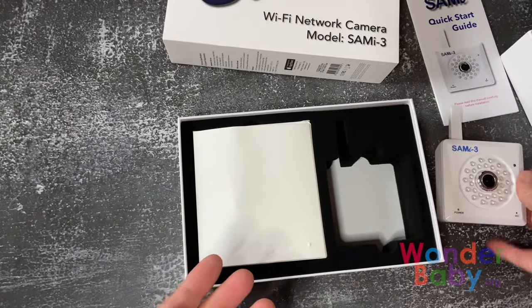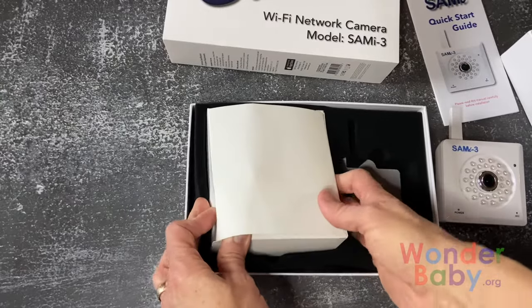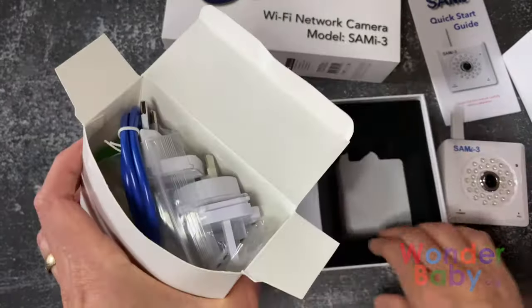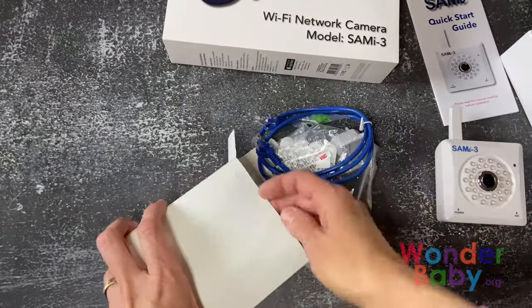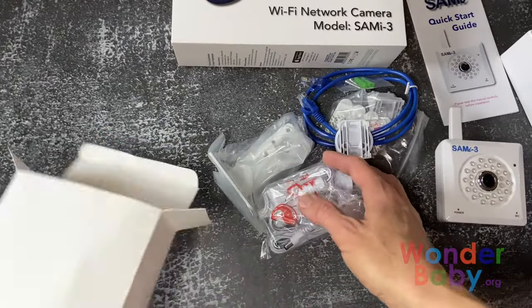We also have this box that has all of the hardware you're going to need to put your monitor together and get it set up. There's the Ethernet cable and a few other adapters.